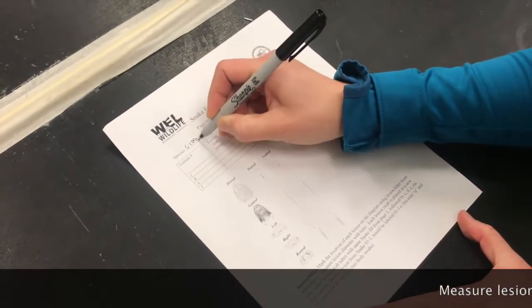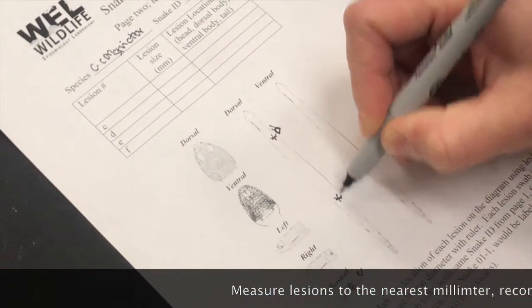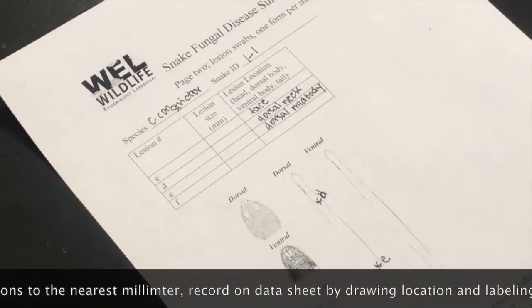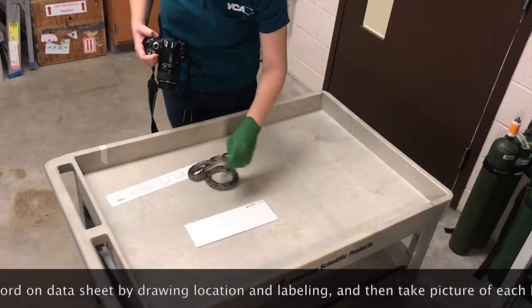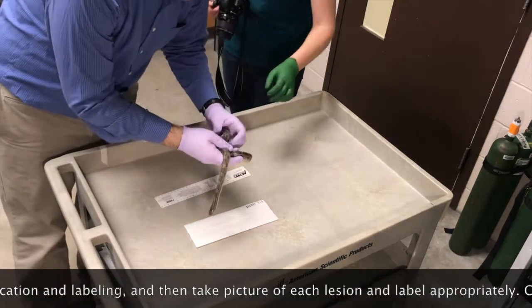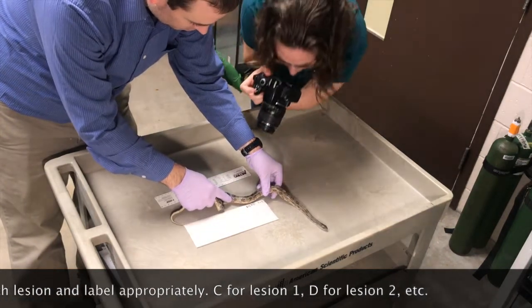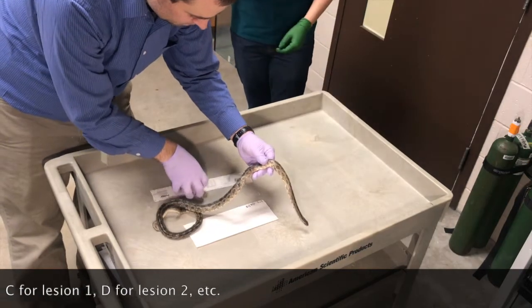Record your findings on the data sheet, including lesion size and location. Each lesion will be assigned a letter as described on the data sheet, and lesions should be marked on the images of the snake on the data sheet. Take pictures of the entire snake, as well as each lesion noted on the data sheet. In each photo, include a label with the installation code, snake number, and lesion letter if applicable. Include a ruler in the photo to indicate lesion size when possible.